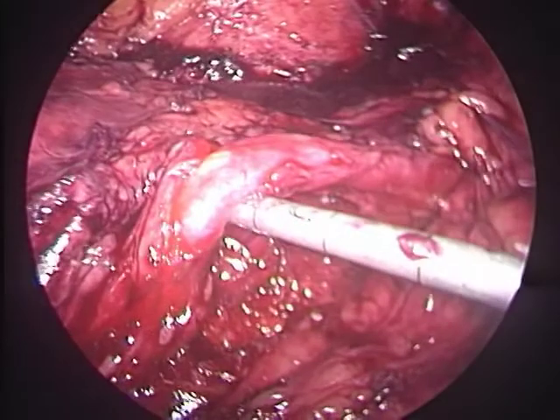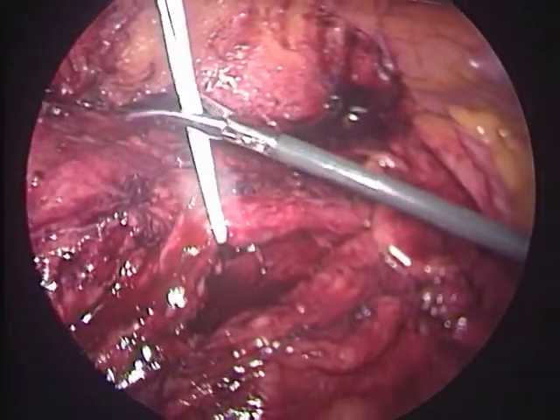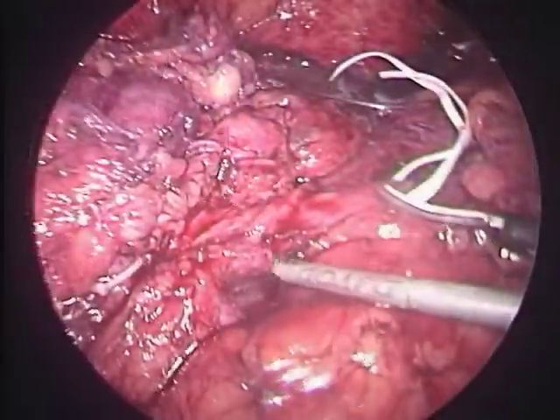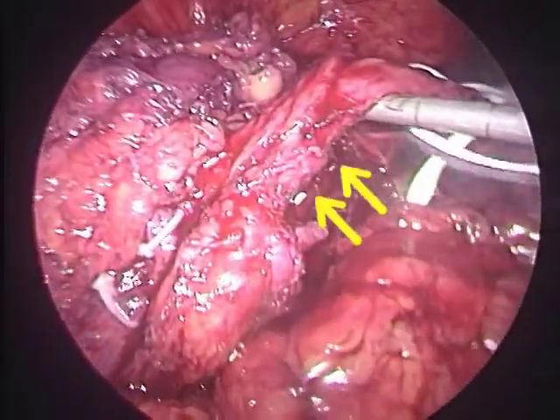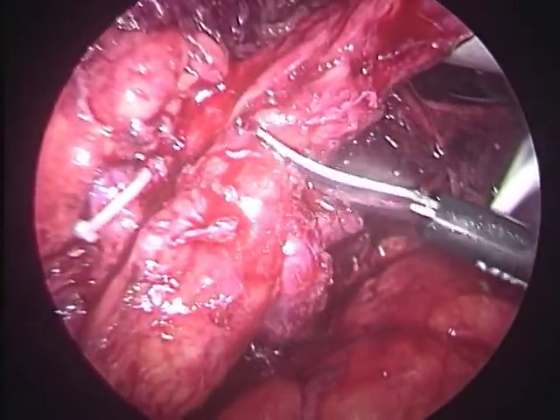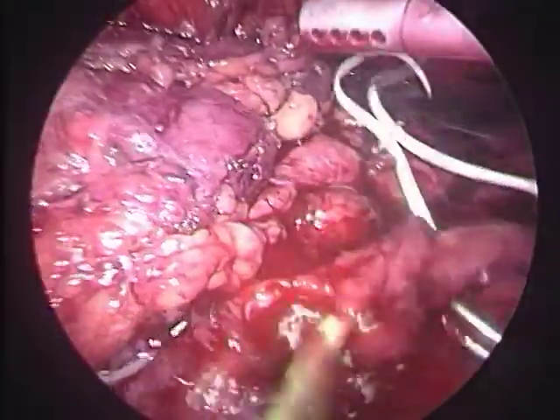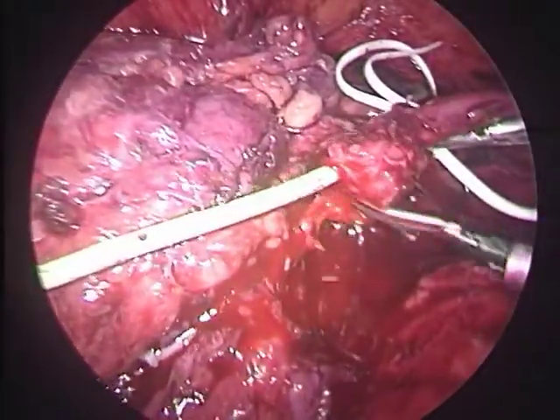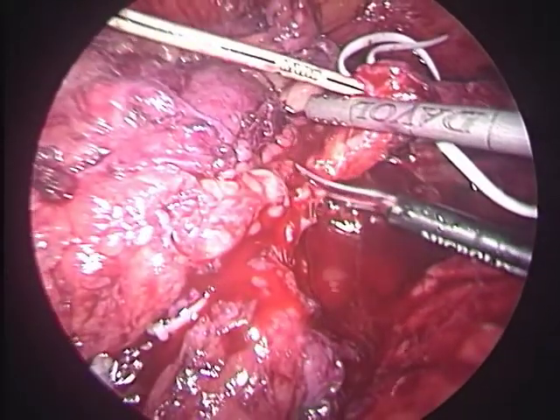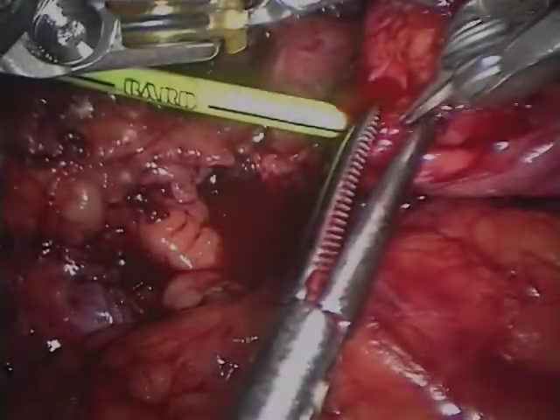The first part of the operation is performed using laparoscopic techniques. The distal ureter is isolated with a vessel loop. It is dissected up to the area of stricture as seen here. The ureter is transected just below the stricture with sharp endoshears. Once the ureter has been transected, the robot is then docked.